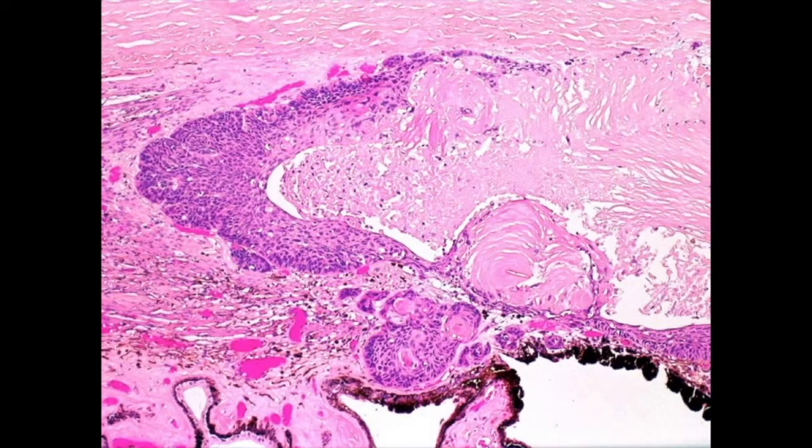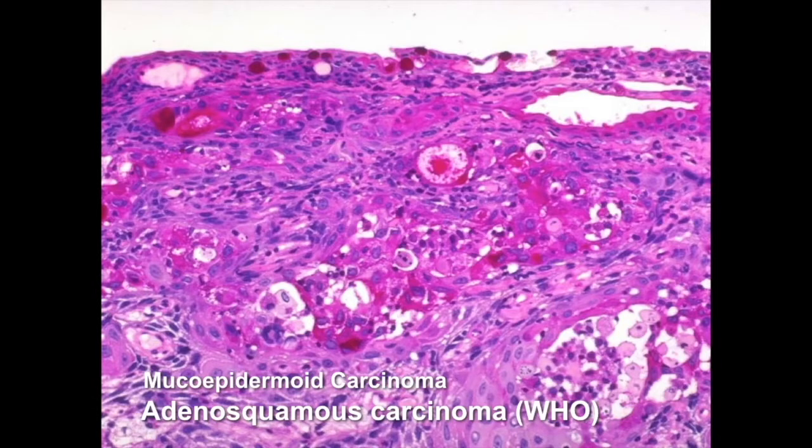This is an example of intraocular invasion by mucoepidermoid carcinoma. There's actually keratin in the anterior chamber in this case of malignant epithelial downgrowth. Again, as I said, this is now referred to as adenosquamous carcinoma. These squamous cell carcinomas do have mucin production and goblet cells.